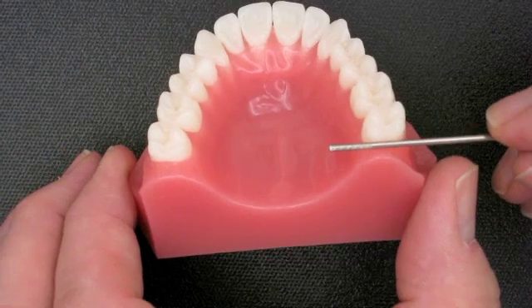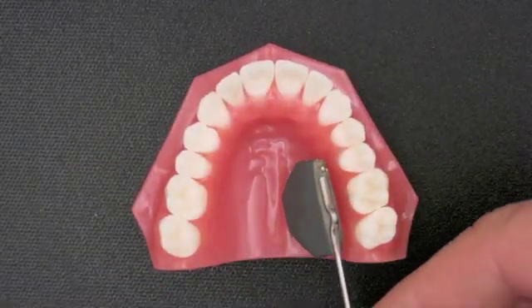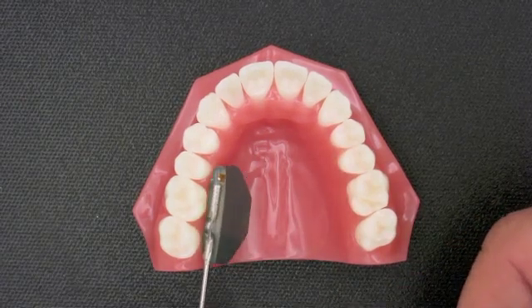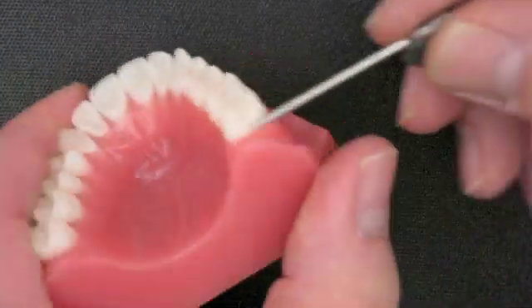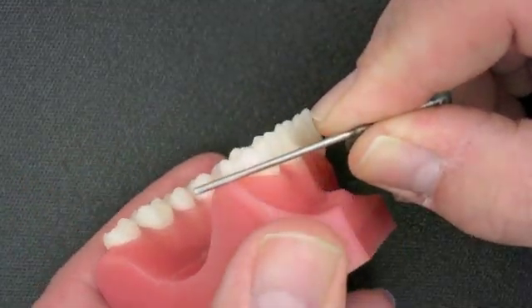The wire that you see has to fit behind the most distal tooth, and that's 061 wire. What you see here is the battery of the ITM. It needs room to fit on the palate. We'd like to see it down low on the palate, but we can also raise it up a little bit on the palatal surfaces of the teeth. And it needs to fit behind here.